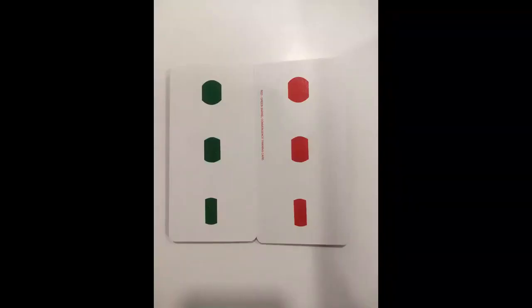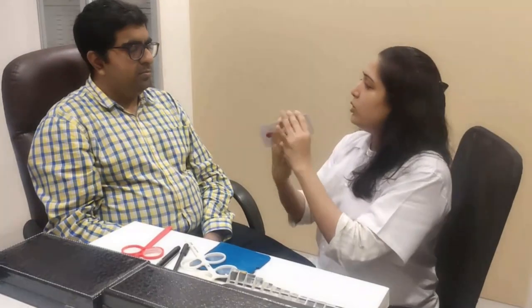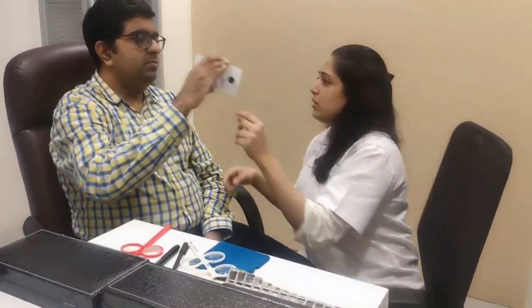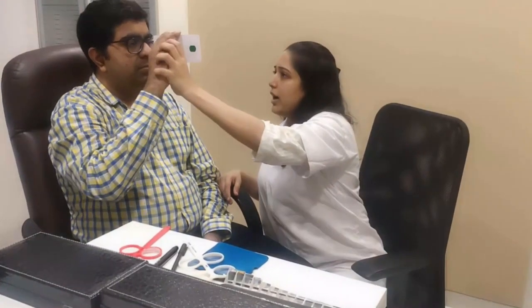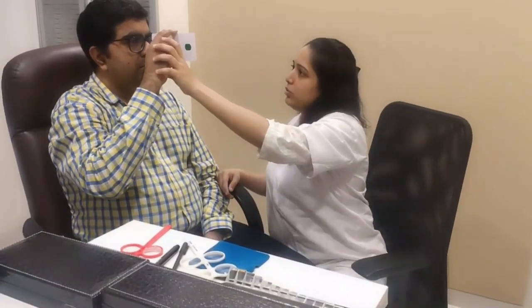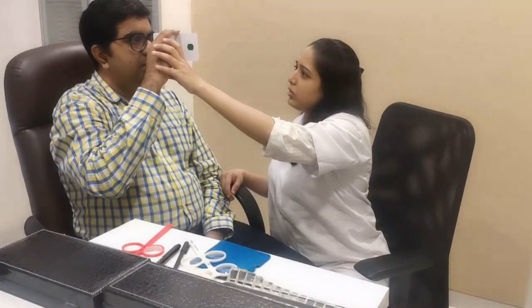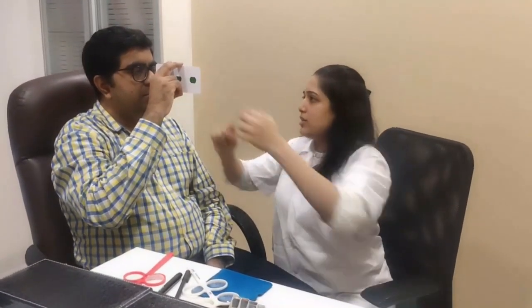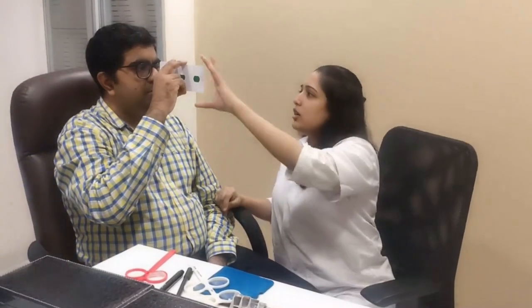The next exercise that we are going to give to the patient for home is the barrel card. Hold this card at the tip of your nose, midline between both the eyes. What are you able to see now? Red and green. Okay, focus on the very last barrel in front of your eyes.